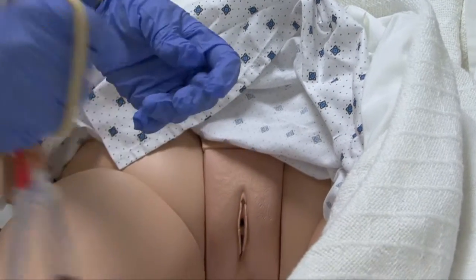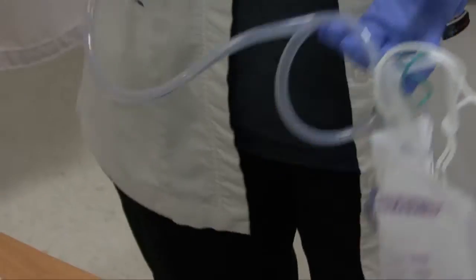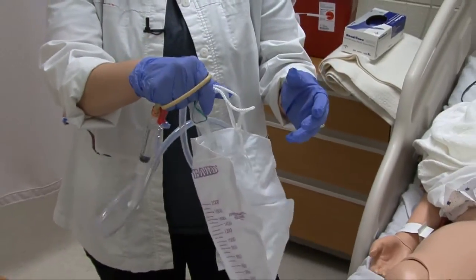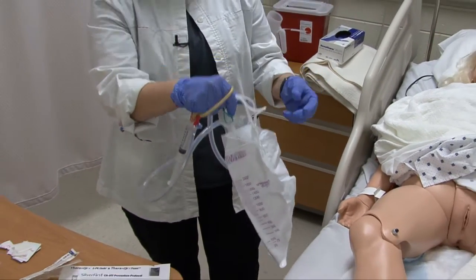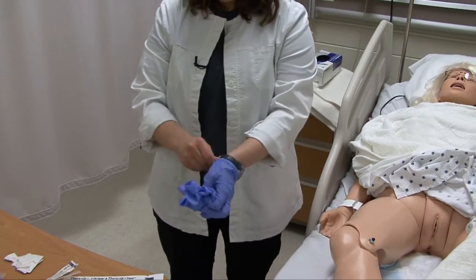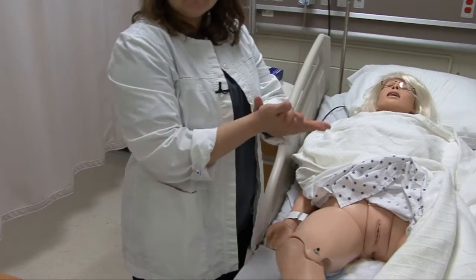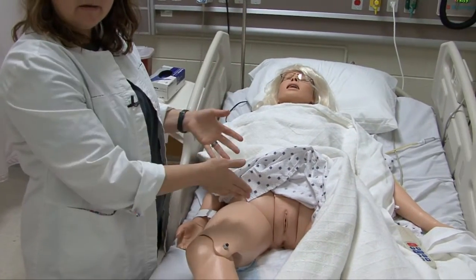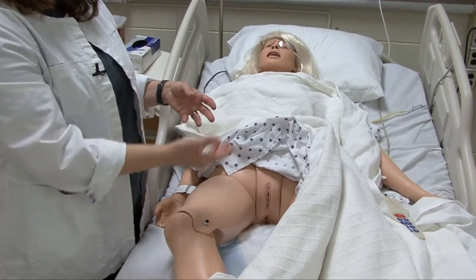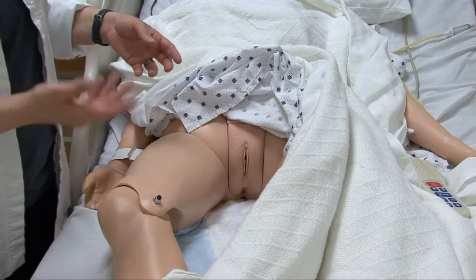Now that it's out, I wrap the catheter in my hand, place it along with the already-drained catheter bag into the red bag or appropriate receptacle for disposal. My gloves are now dirty, so I take them off, foam, put on clean gloves, and provide perineal care again at the end of the procedure. I need to clean her up after pulling the catheter and remove the waterproof pad from underneath her.